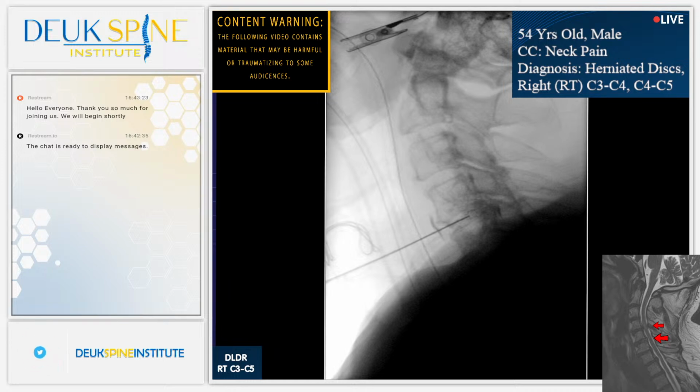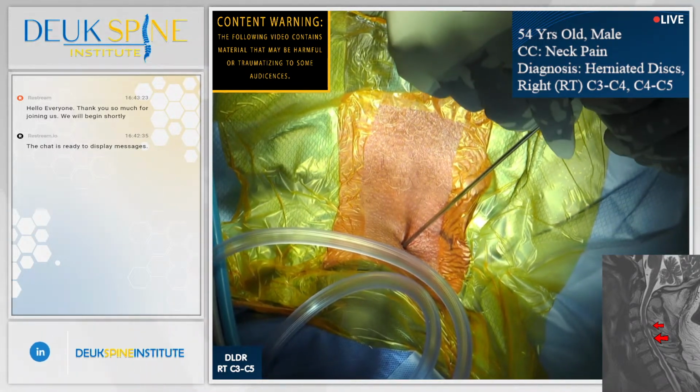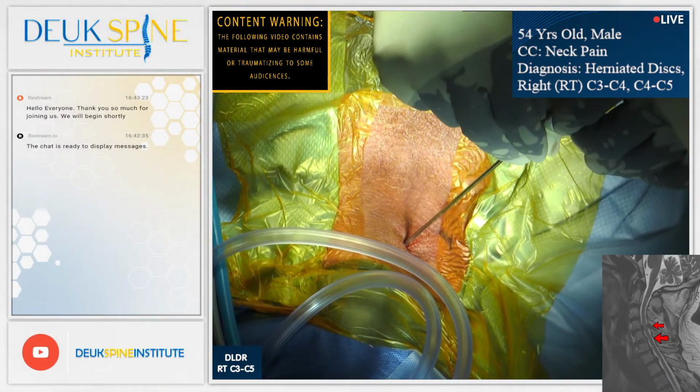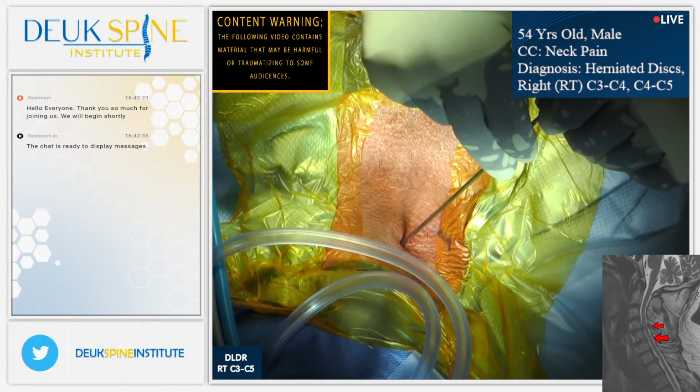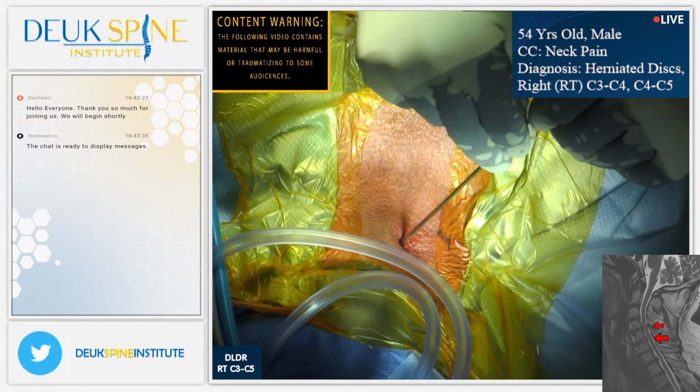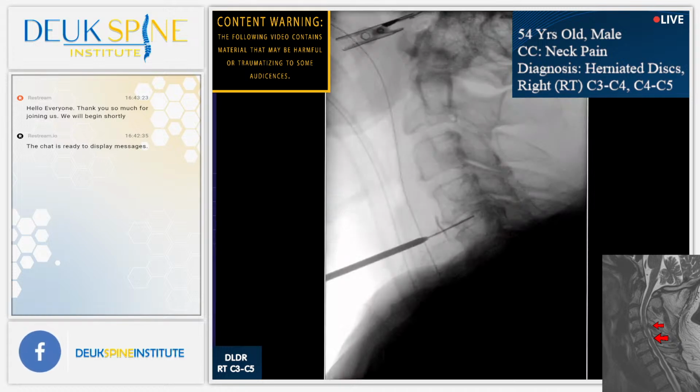I'm leaving the guide wire, removing the needle. Thank you. Going to bring the dilator down. We've probably got a nick on the external small vein. All right, heading down. Shot. Perfect. I think you fixed the orbit, but not completely. Let's do another degree. Can you guys see which disc we're going to? Number 2, 3, 4, 5. Everyone agree? 4, 5. Shot. Thank you, Luis. Almost there. Yep. And again, I'm using the guide wire to guide the dilator.